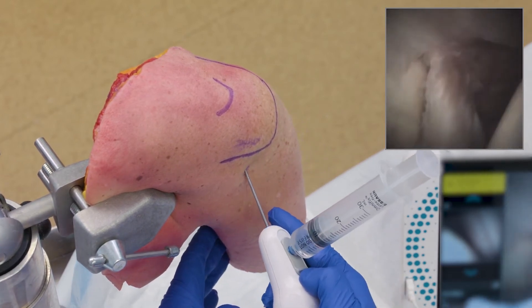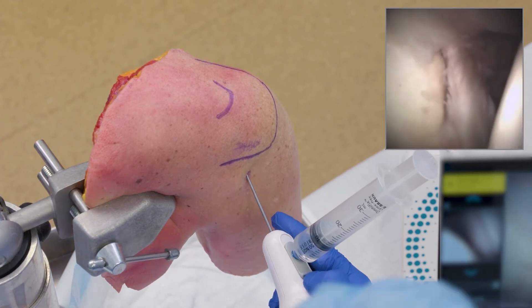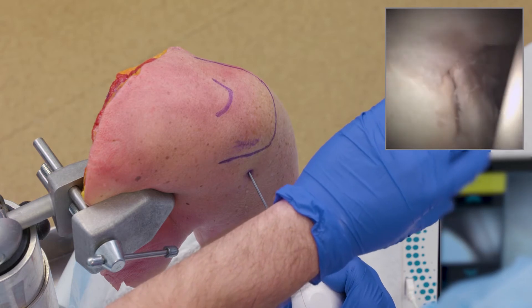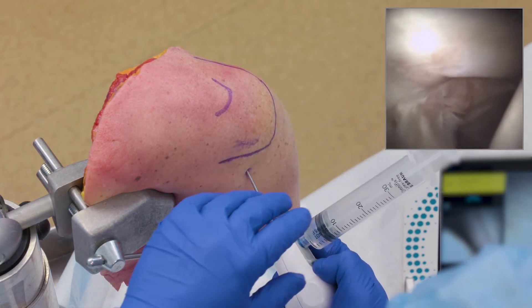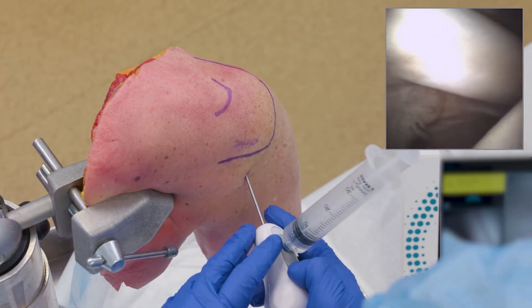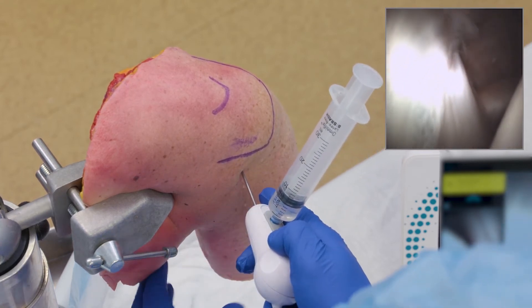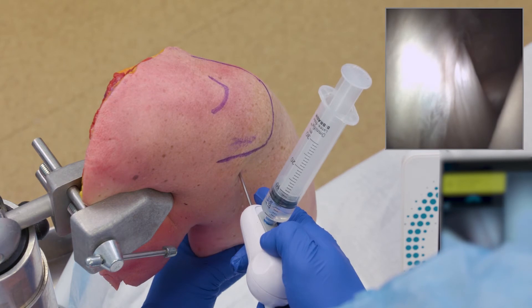Sometimes I'll get asked how I can palpate the labrum to see if it's unstable. The first thing is giving a little flutter or flush, which sometimes will make it elevate up. But if I can't, I can come in through my rotator interval. Looking at things here, I can come right underneath my biceps, above my subscap, which is directly in front of you at about the equator of the picture, and evaluate where my soft spot's going to be.